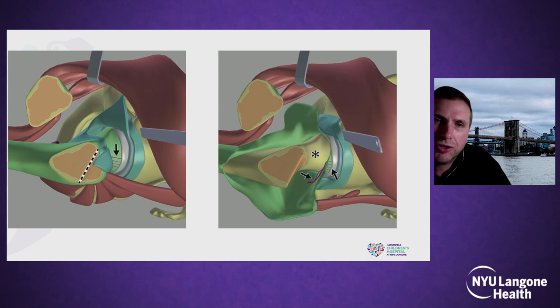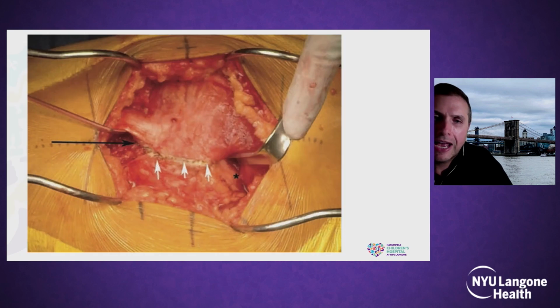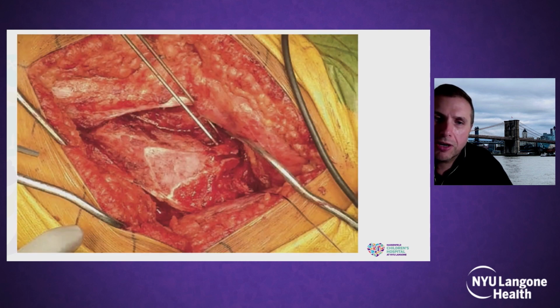And thanks to the surgical approach, the safe surgical dislocation as described by Professor Ganz, we can now do a safe surgical dislocation by protecting that vessel, the retinacular flap with the vessels that go into the femoral head. And this allows for a very powerful realignment of the proximal femur. This is showing the technique. We do a trochanteric flip osteotomy.